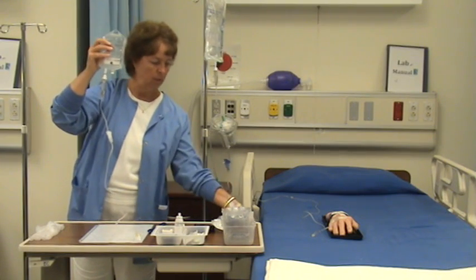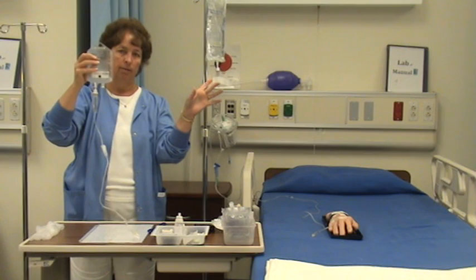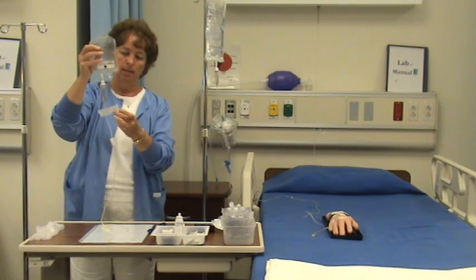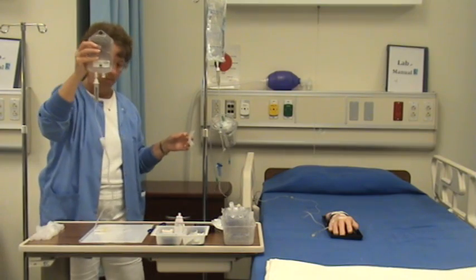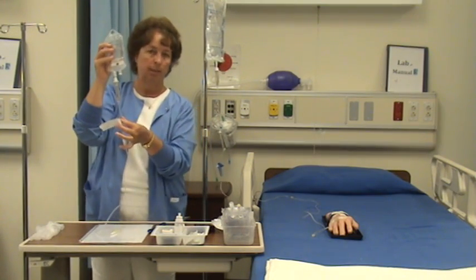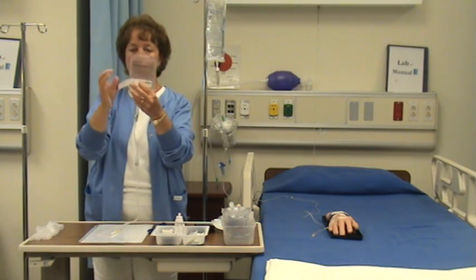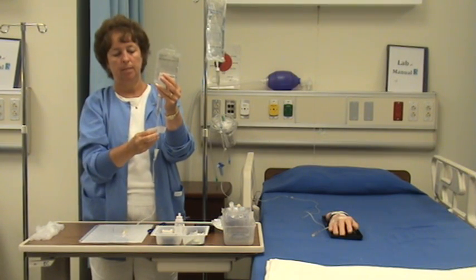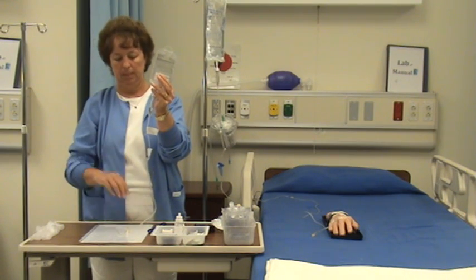And then if I were in the medication room, another thing that I would want to do is take a tape or some kind of identifier of when I hung this, when I put this IV piggyback tubing onto the medication. Usually tubing, just like the primary tubing, is good for 72 or 96 hours. So we want to document when we put that up. So I've got the time, the date, and my initials on that.